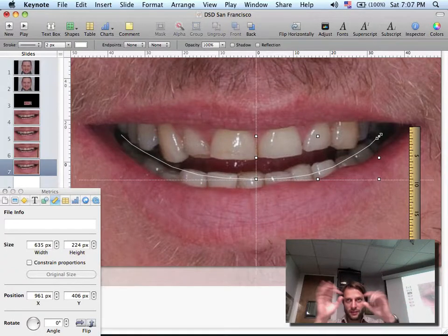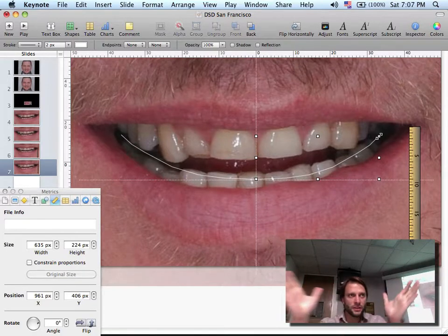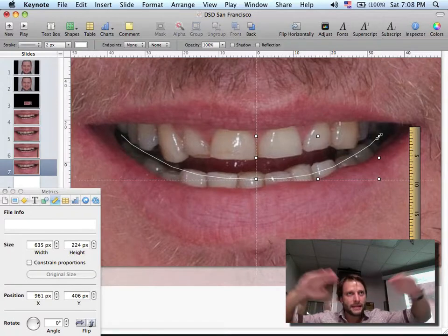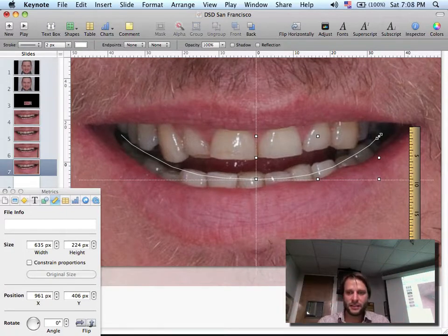We're going to look at the incisal edges when they smile, and we're going to see how we're going to shape it. Imagine if one side of the provisional is touching the lower lip too much, we're going to trim that until we create a nice curve. So that's exactly what we're going to do here. So you can change this line.